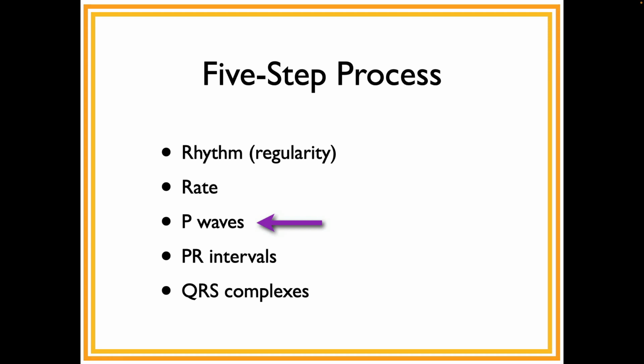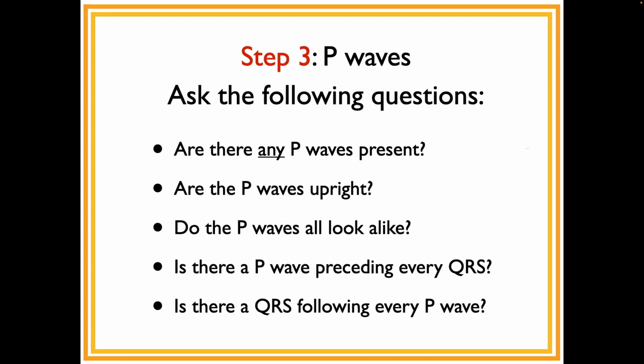Okay, step 3, and it will help you. By the way, these steps are put in that order for a reason. So when you do this 5-step process, you'll find it's more efficient if you do it in the order given. So step 3, we ask a lot of questions about P waves, and actually these are very similar to those questions we asked last week at the end of class when we were doing that exercise.